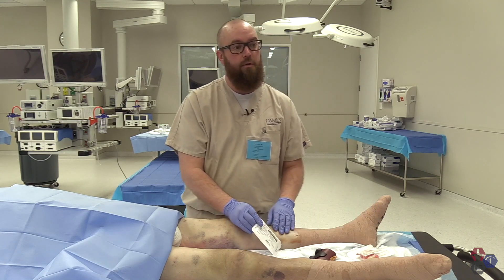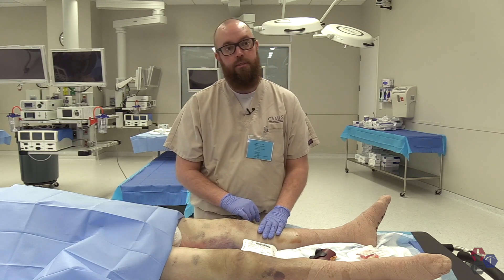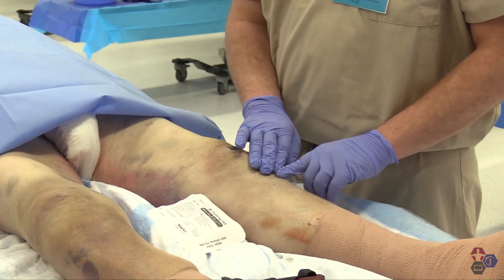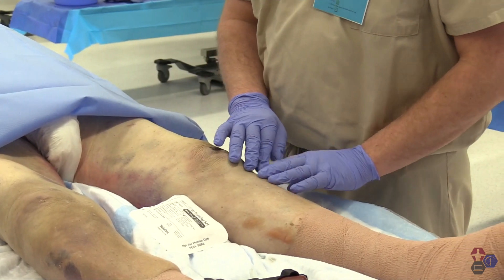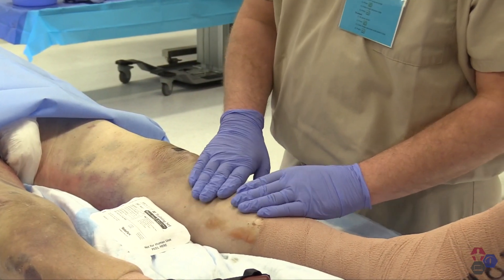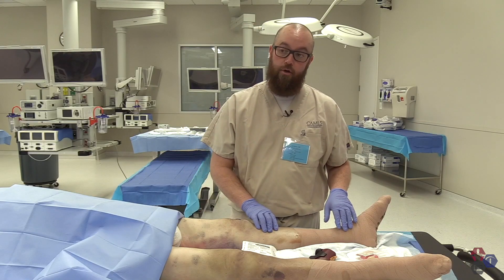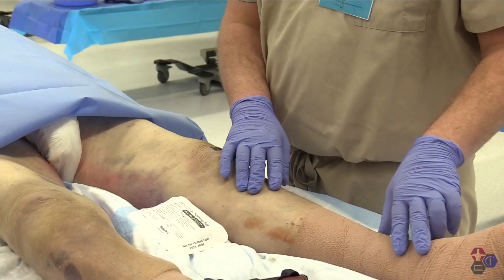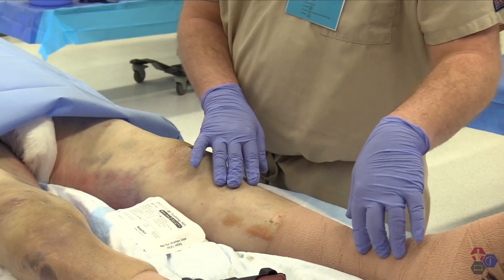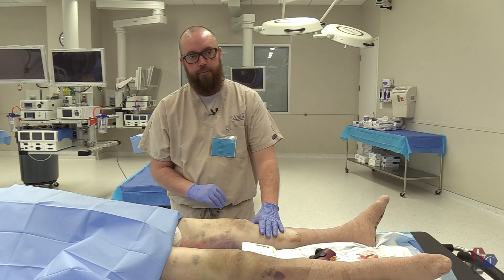For the placement of IO, there are several places you can put it. The most widely accepted is along the medial aspect of the tibial plateau — two to three centimeters below the tibial tuberosity on the medial aspect, where there is a large bone mass. The other placement site is along the distal tibia, just superior to the medial malleolus and posterior to the saphenous vein, though that's not as widely used.